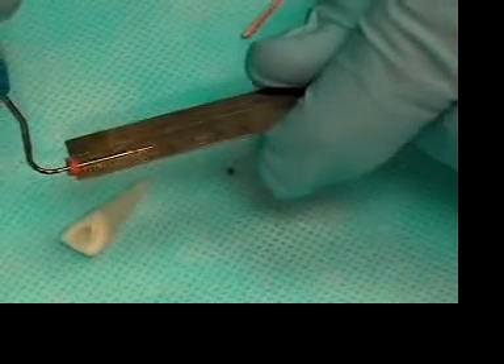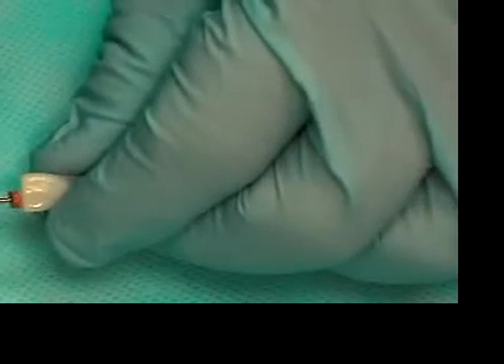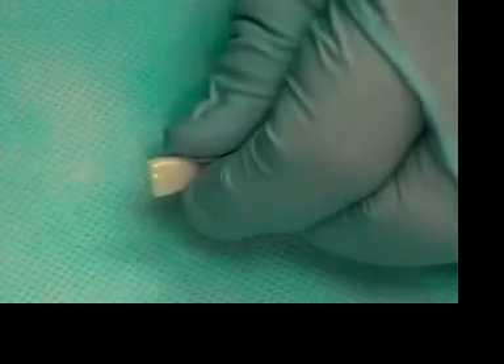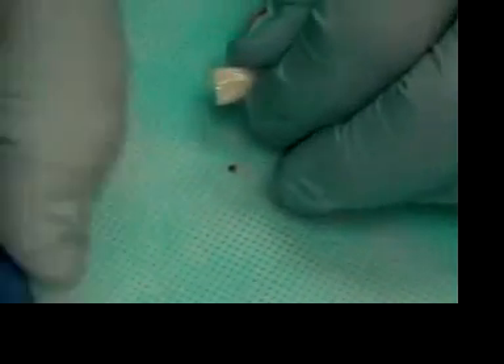Let's use our next smaller plugger, which is the number 8, and we'll set that to 18 millimeters. We set that in the canal, and this goes down to 18 millimeters again without binding. So these are our two pluggers: the first plugger is the number 10 plugger, and the second plugger is the number 8 plugger.